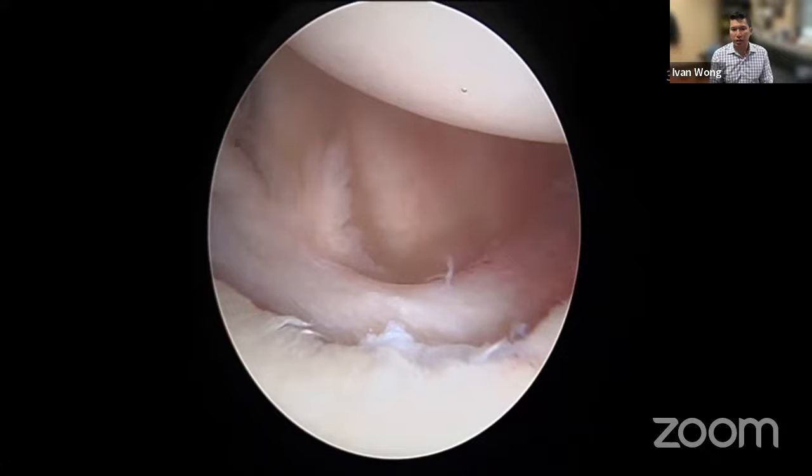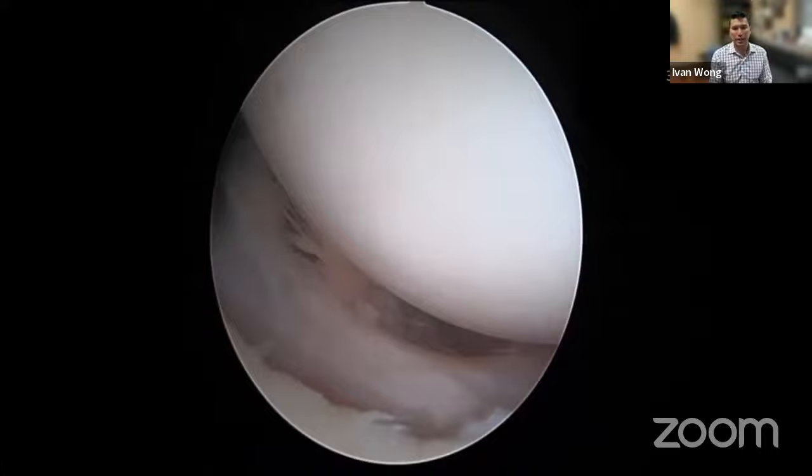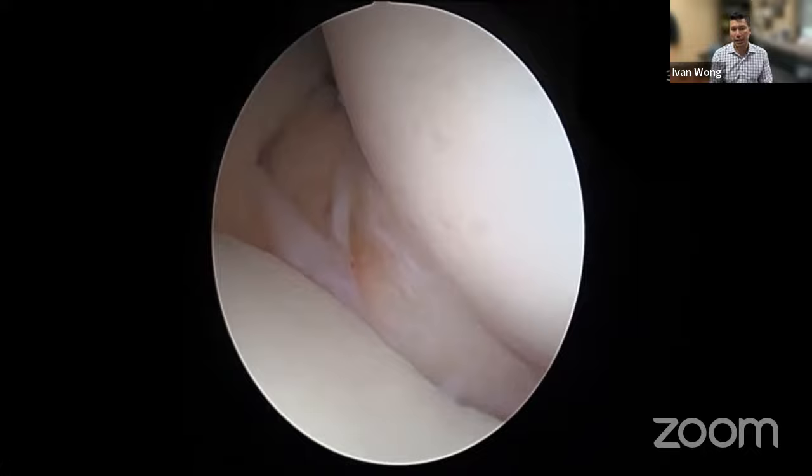Viewing from the back, the anterior labrum is completely detached with not much tissue visible — it's very tough to see. This is exactly why we switch to viewing from the anterior superior portal, because you can see the tissue much more clearly from there. Whether in beach chair or lateral decubitus setup, you always want to view from the anterior superior portal.